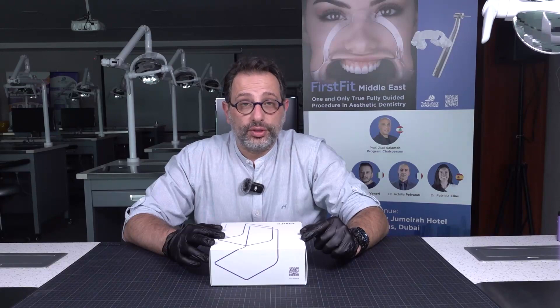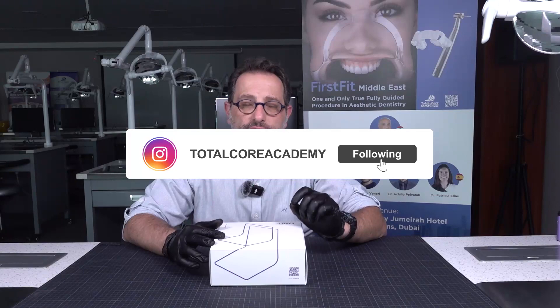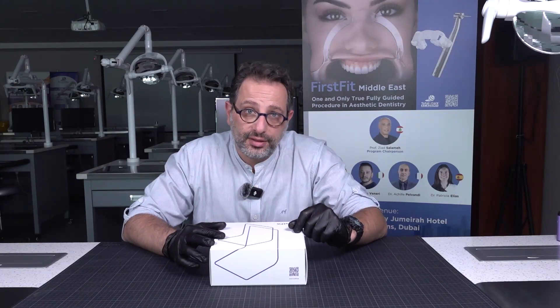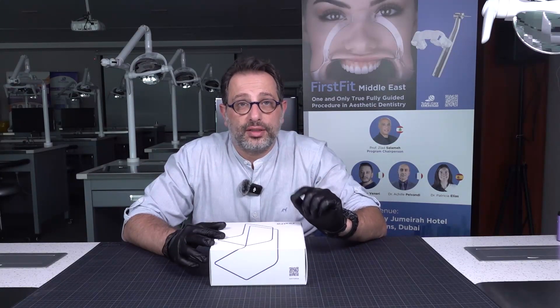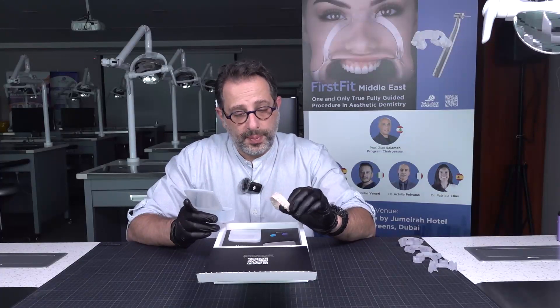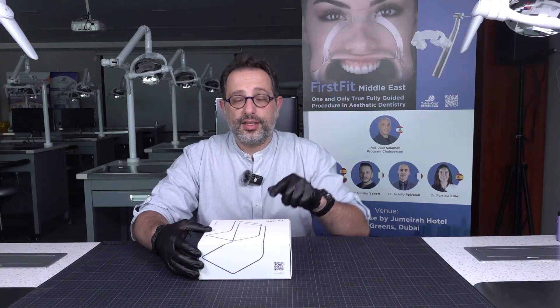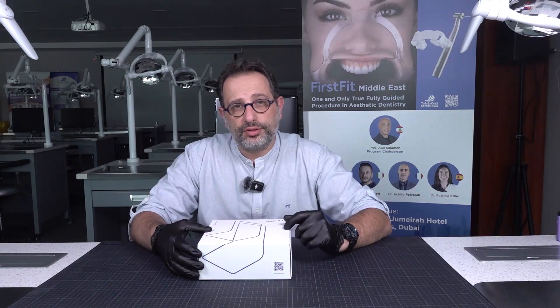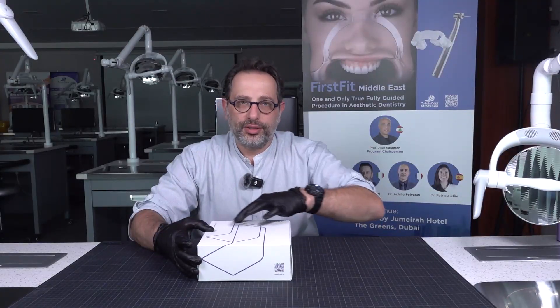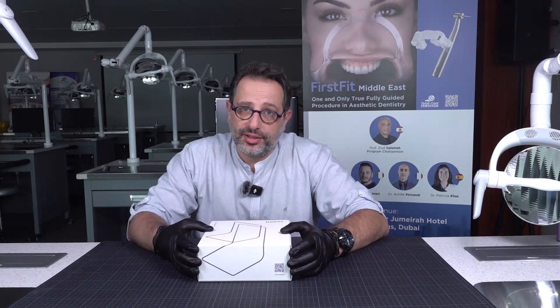We have exciting news for you. Do you want to know how to deliver veneers to your patients within one hour — only 60 minutes? First Fit is the new product that Total Core General Trading is introducing to the market. All you need is this small, beautiful package of First Fit to deliver your veneers within 60 minutes.